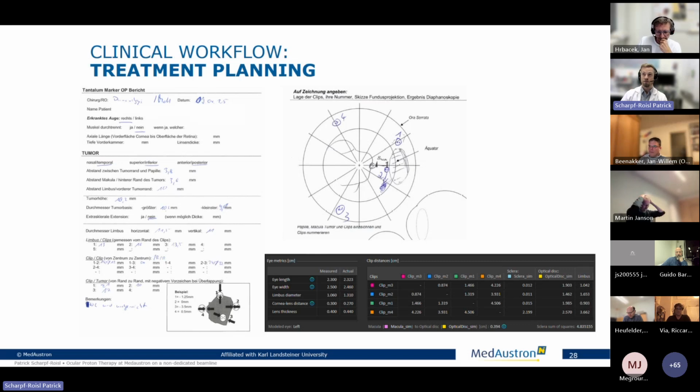we talk here about 40% beam on-time reduction. So roughly 1 minute to 1.5 minutes of treatment time. That's what is on the horizon, I would say, within the next 1-2 years. Further, I think then we're also pretty much at the limit, honestly.